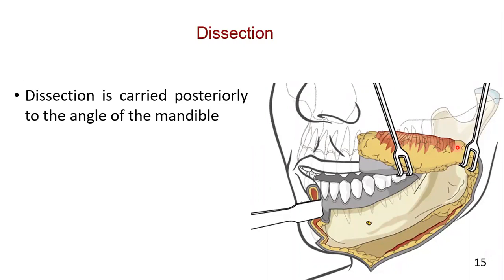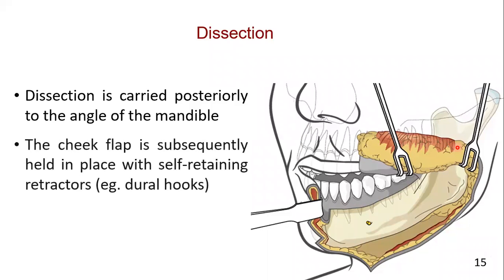Dissection is carried posteriorly to the angle of the mandible, or as far as needed to provide access for the oncological resection and placement of a mandibular reconstruction plate when indicated. The cheek flap is subsequently held in place with self-retaining retractors, for example, dural hooks.